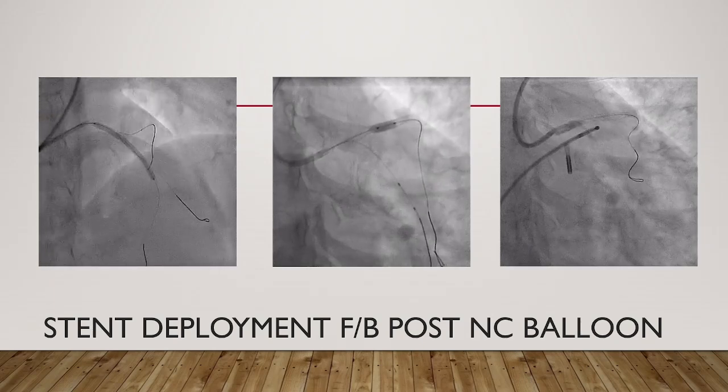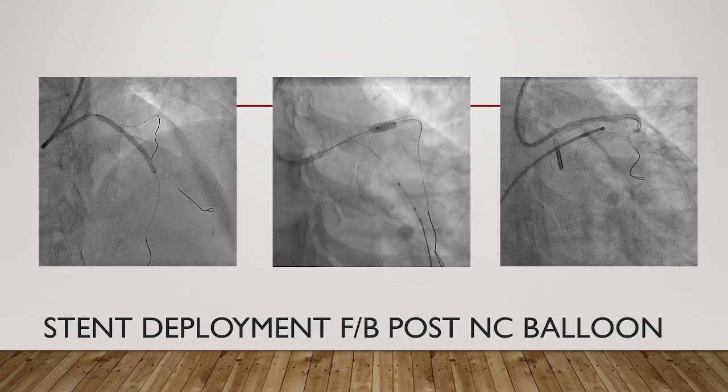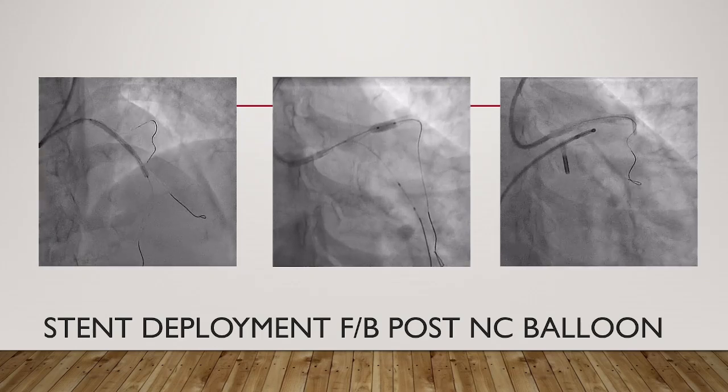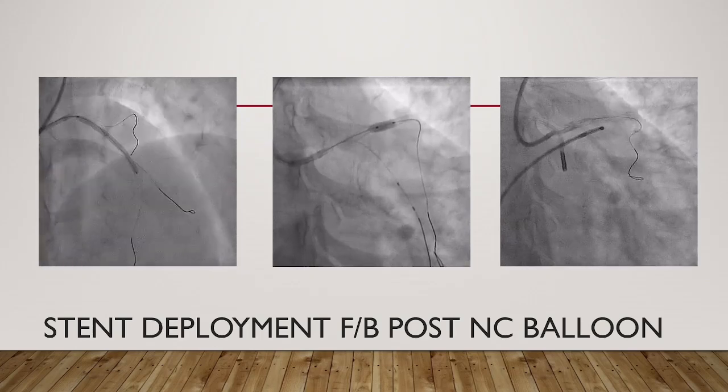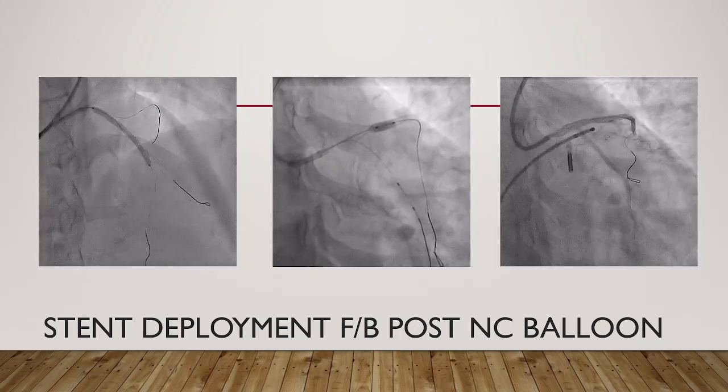Patient collapsed and had a cardiac arrest, had to be intubated, and IABP was put in. But we are clear in our mind what we are dealing with because of our imaging finding. We knew there is a large necrotic core, which is the problem.